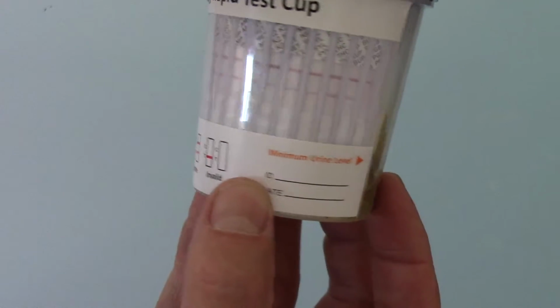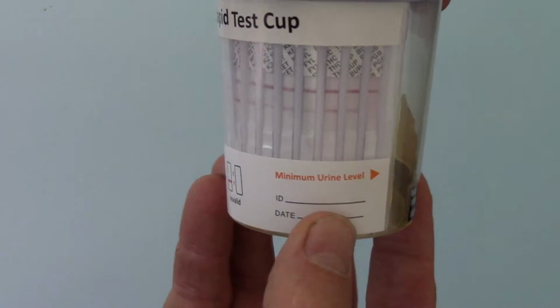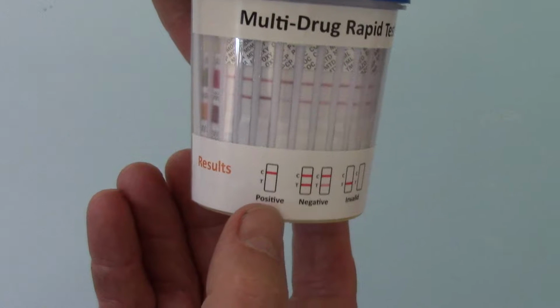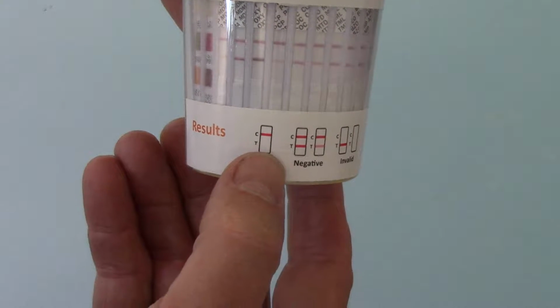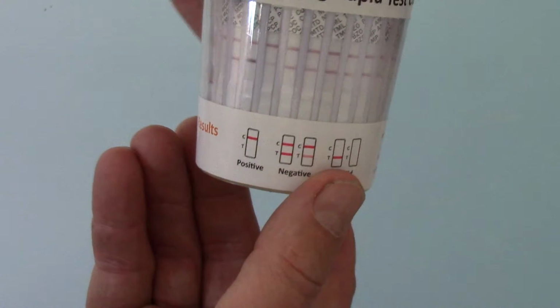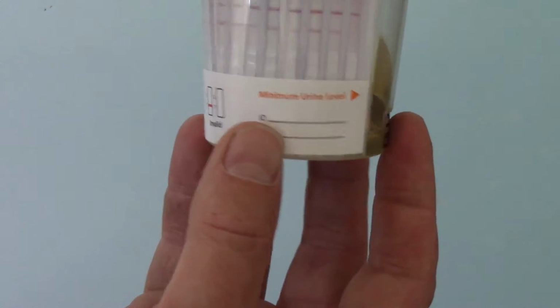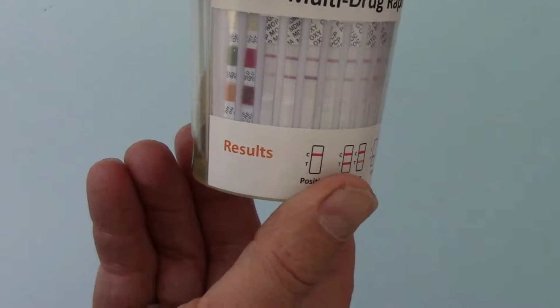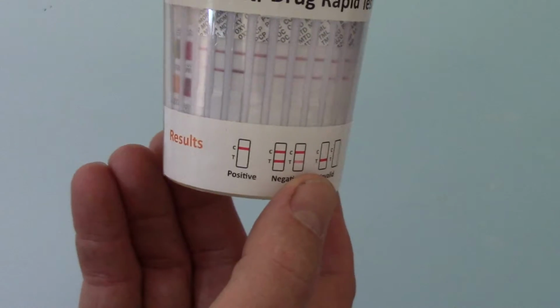Now what you've got to do here is wait for the full development time of this drug test before you interpret any positive results. A positive indicator is shown as a control line in the absence of a test line, so no test line forming at the read time for the test, which is between 5 and 10 minutes. Now, if you do get all negative results showing in a shorter period than that, you can move on to the next test, because these test lines, once they're formed, are not going to fade or disappear.